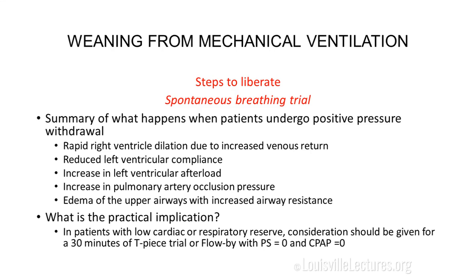So then what is the practical implication of all of this physiology? The practical implication is that you need to be really careful when you're dealing with patients who have low cardiac or respiratory reserve, patients who have systolic heart failure, bad COPD. In these patients, it might be a good idea to do a 30 minute T-piece trial or flow-by. So you leave the patient connected to the ventilator, but use pressure support of 0 and CPAP of 0. Even though there are not many studies in the literature supporting that, anecdotally, we do see some patients who just crash after they get extubated.